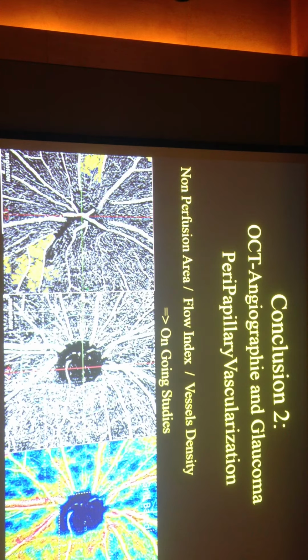You know, this kind of approach can probably be very powerful if we keep in mind that we have to point out that the analysis can be done by any technician, by any engineer, but the acquisition at the time the patient is in front of you is the main key of the results and the main key for limiting the false responses and the false analysis.